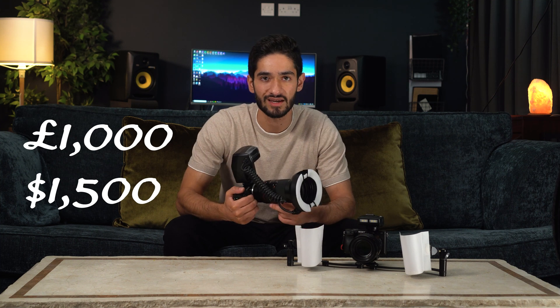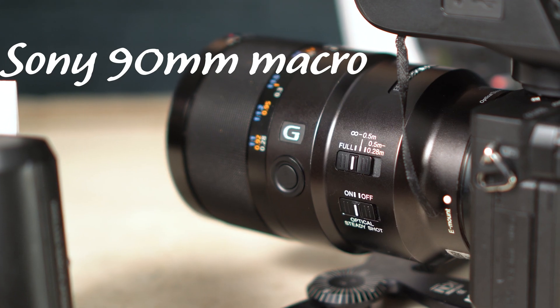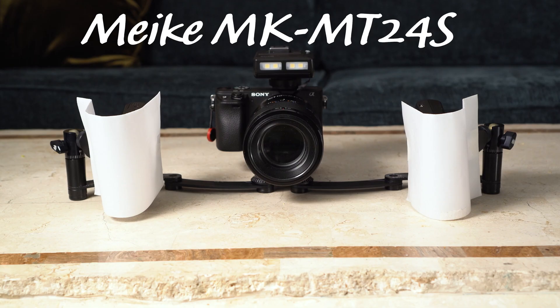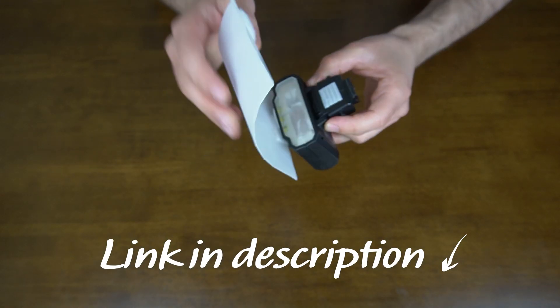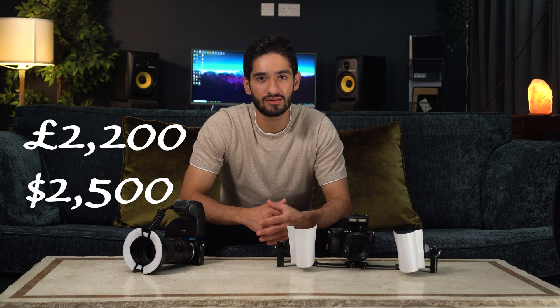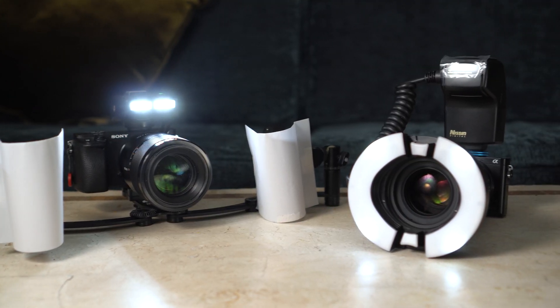In the more advanced setup I have a Sony a6400 with the Sony 90mm macro lens and the Meike twin flashes, all mounted on the OWL bracket, along with some diffusers I made myself — you can check out the equipment video to see how I made them. This setup is more expensive at around £2,200 or $2,500, but there are a few key differences between the two setups.